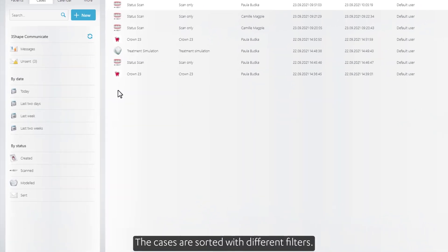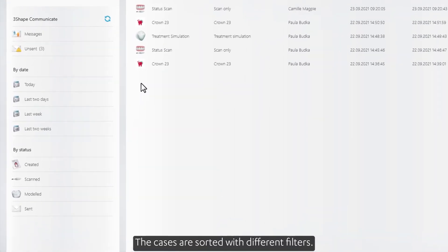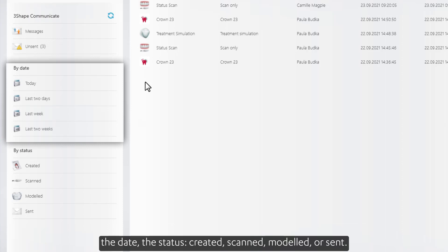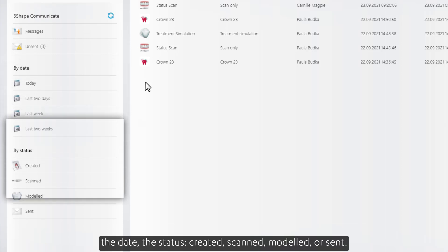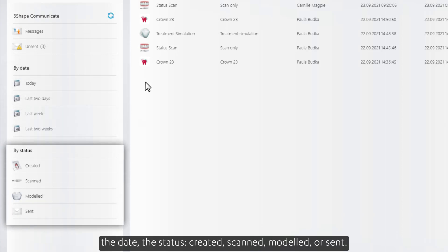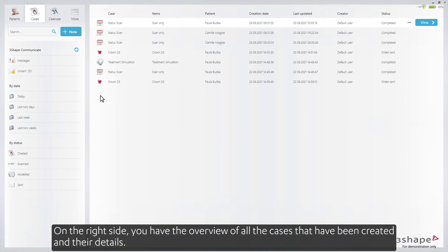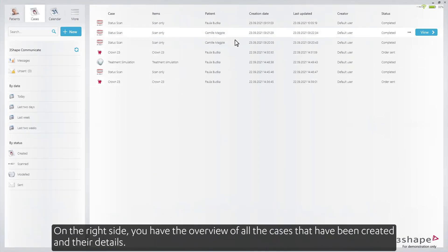The cases are sorted with different filters. You can filter all the cases according to 3Shape Communicate Messages and Unsent Cases, the Date, the Status — Created, Scanned, Modelled, or Sent. On the right side, you have the overview of all the cases that have been created and their details.